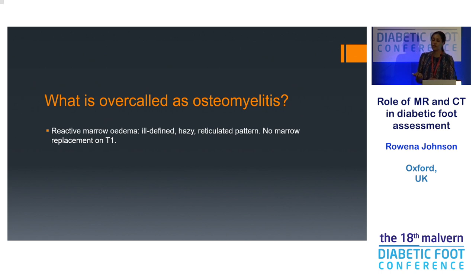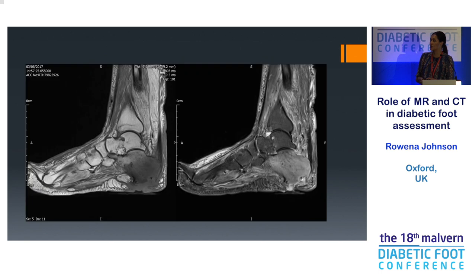What is overcalled as osteomyelitis? Reactive marrow oedema — I keep repeating it because it always gets overcalled. On this sagittal of the foot, you can see the big ulcer at the heel going up via a sinus tract, and the whole calcaneus is of abnormal signal — initially reported as osteomyelitis throughout. But the corresponding T1 shows the osteomyelitis is extensive up to a certain point but does not reach the subtalar joint. The area above that shows reactive marrow oedema — fat is still visible there. That's not infection.